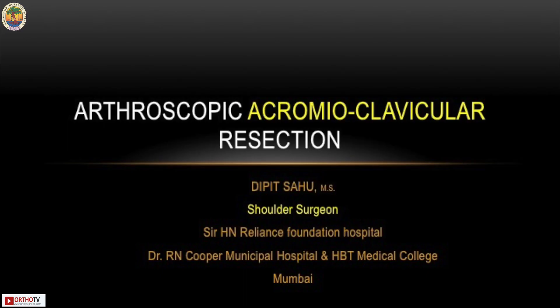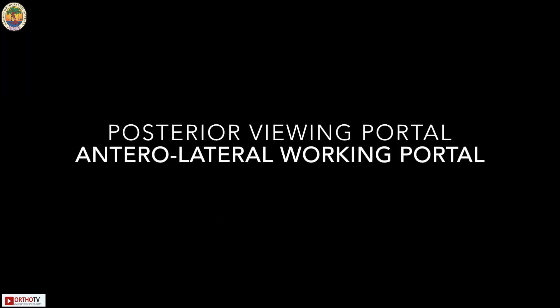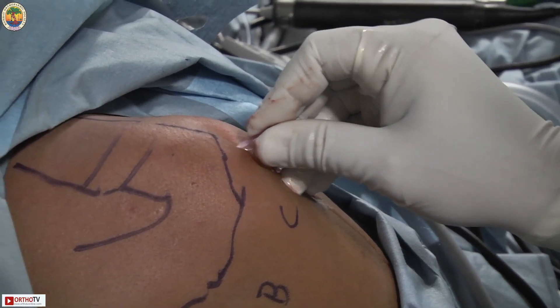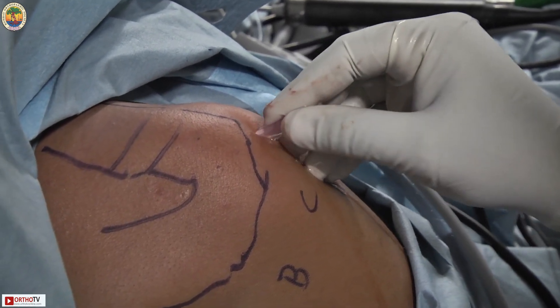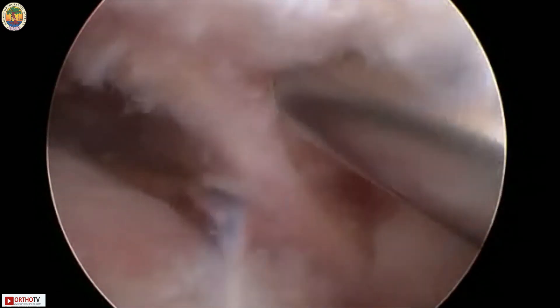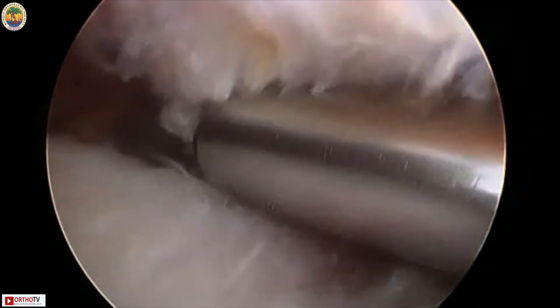This video is about arthroscopic acromioclavicular resection. We start with the patient in beach chair position and posterior viewing portal. We mark our portals A, B, C, D, and E, then we make an anterior lateral portal on the anterior lateral corner of the acromion. We then start with subacromial decompression, going directly towards the AC joint.